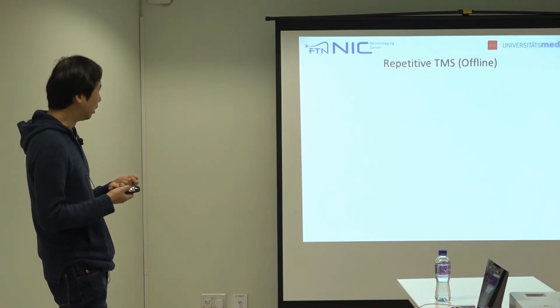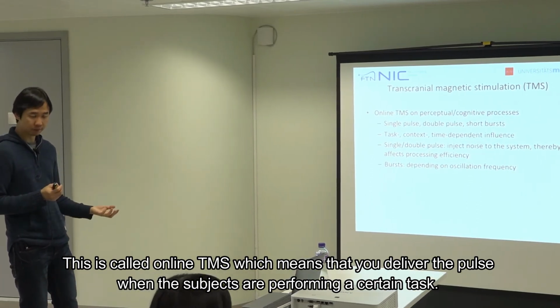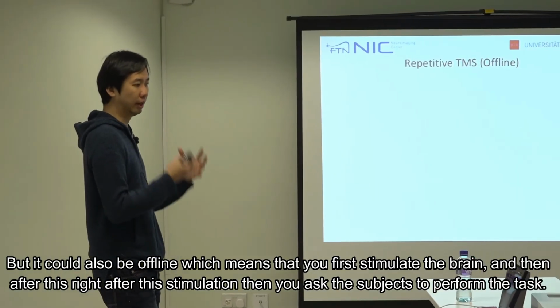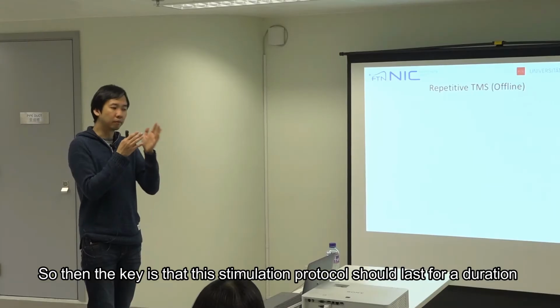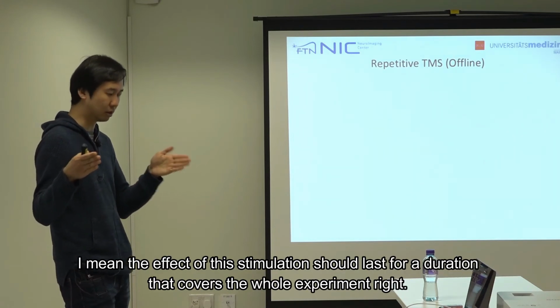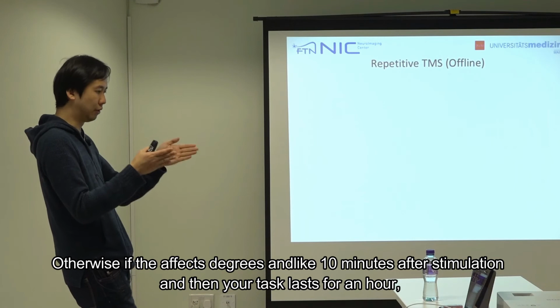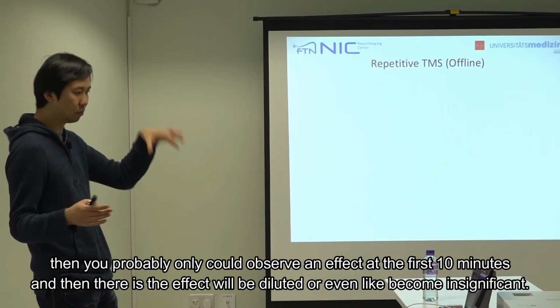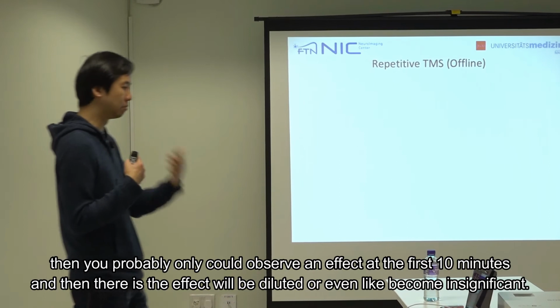So yeah. All right. So this is called online TMS, which means that you deliver the pulse when the subjects are performing a certain task. But it could also be offline, which means that you first stimulate the brain, and then right after this stimulation, you ask the subjects to perform the task. So the key is that the effect of this stimulation should last for a duration that covers the whole experiment, right? Otherwise, if the effect degrades at 10 minutes after stimulation, and your task lasts for an hour, then you probably only could observe an effect in the first 10 minutes, and then the effect will be diluted or even become insignificant.